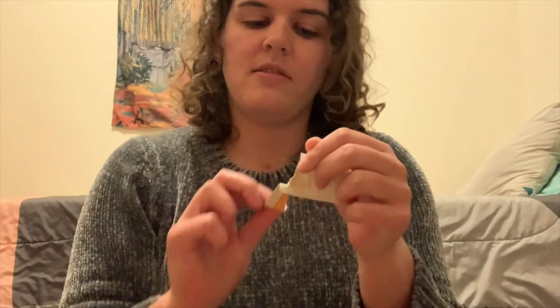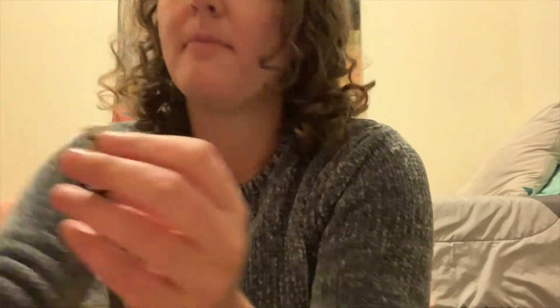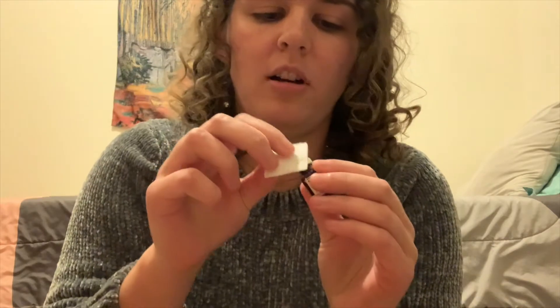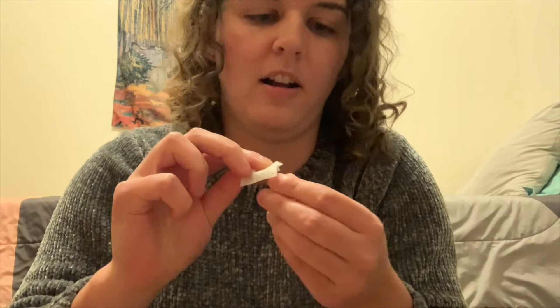Remember, you want anything that you put into your body to be sterile, so we need to sanitize everything. I have some alcohol wipes here — little squares that I use. You just want to open one up, then take your vial and pop the cap off. Take your alcohol wipe and make sure the top is cleaned off really well to make sure there are no germs on there at all. Then let it dry. You can take the same wipe and wipe off your leg on the spot that you're going to inject.